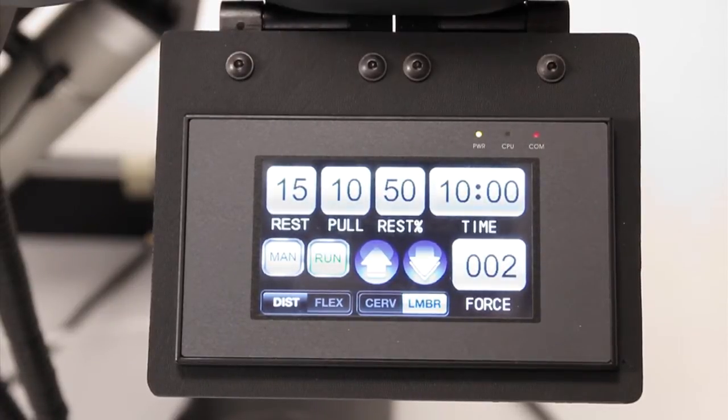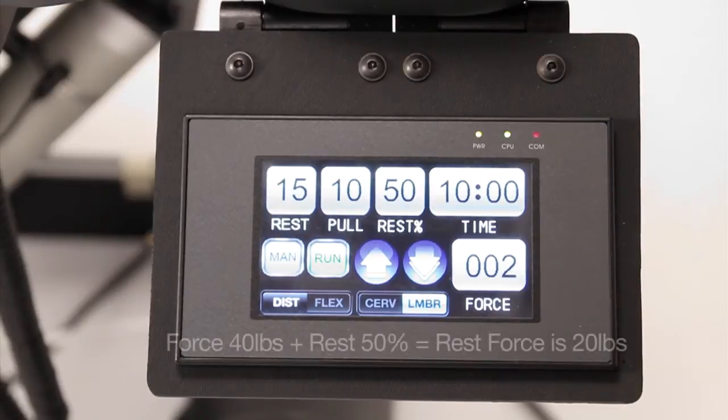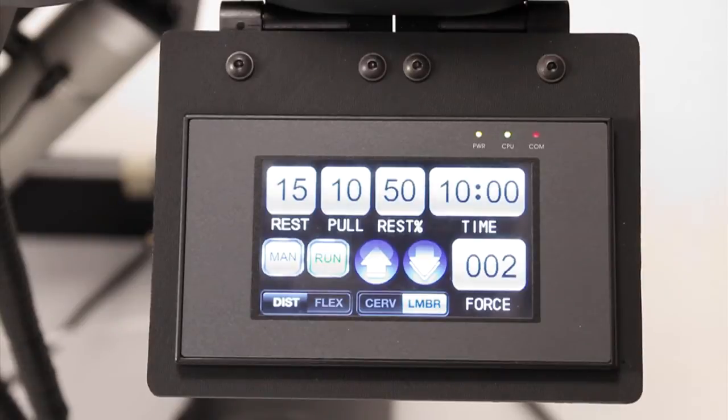The rest percentage setting controls the force during the rest cycle. This setting is limited to 50% or 25%. For example, with a force setting of 40 pounds during the pull cycle, setting the rest percentage to 50% will administer 20 pounds of force during the rest cycle. The time setting controls the total amount of time for the treatment from beginning to end.